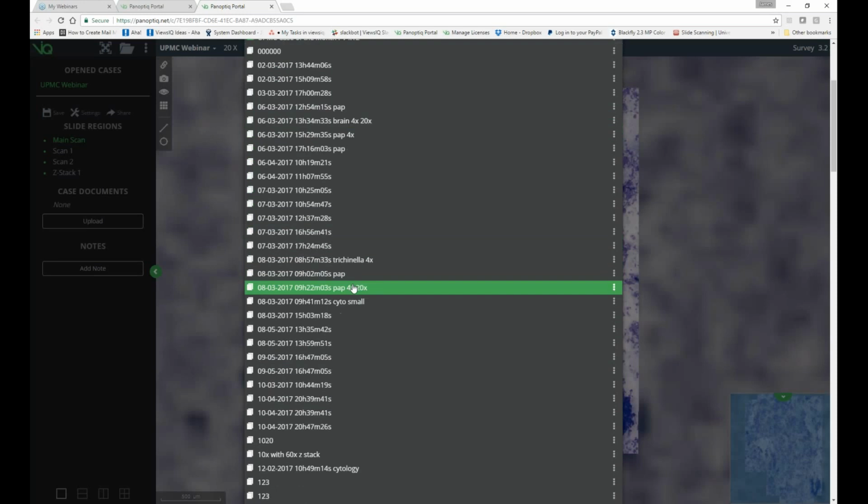Within the portal, we have our file explorer. You can see the full list of scans that you're currently storing, generate links, etc. So I'll pass things back over to Matt, who will explain how he's used the portal to facilitate endeavors in education and social media.